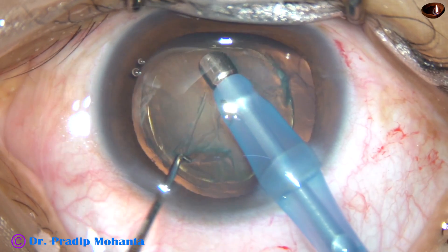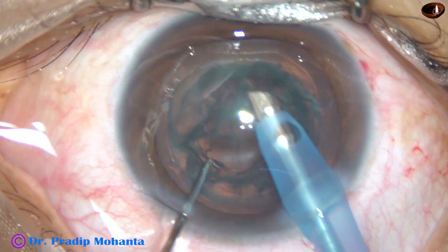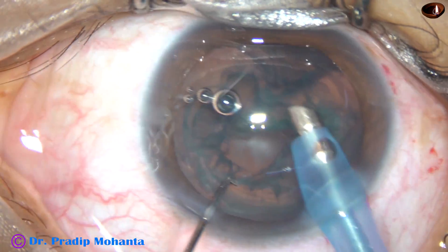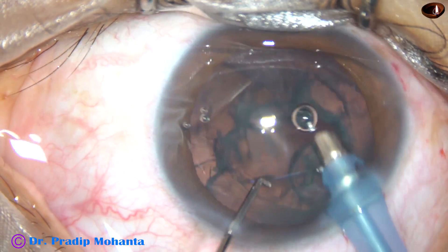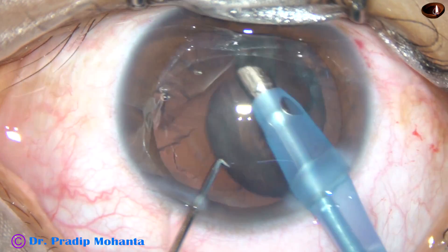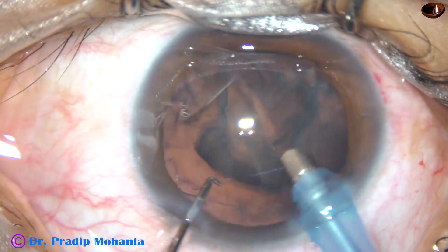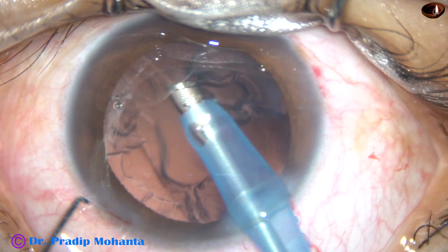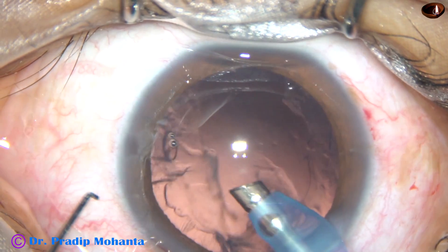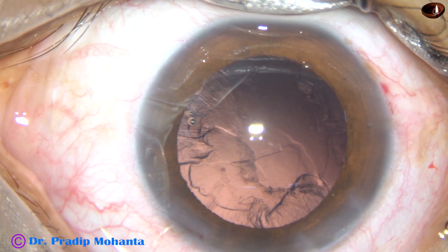Go bevel down. Remain bevel down and try aspirating. Just apply some vacuum and you have seen the nucleus has come out — that is, the central portion has come out, and this is the epinucleus. This is real-time surgery, totally unedited. See how quickly you have removed the lens matter. That is the nucleus and epinucleus. In this case the nucleus is actually soft lens matter.